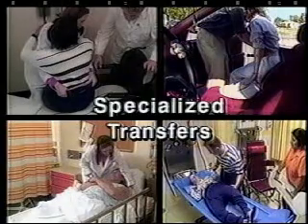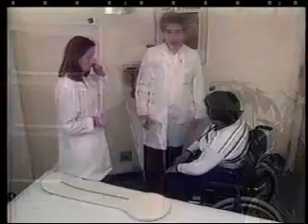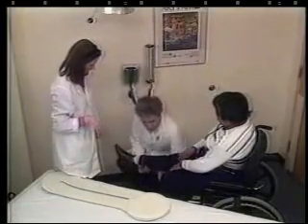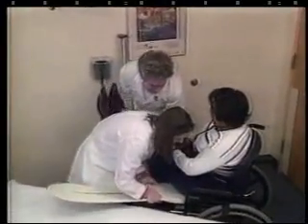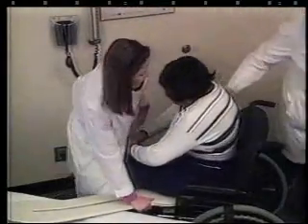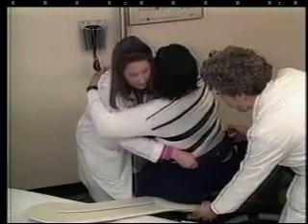With some wheelchairs, it is not possible to remove the arms. There are some little things you learn from doing that will help this transfer. One such technique is to approach the patient in a more head-on attitude than you would if the arms were removable. You can further assist the patient by lifting both legs and placing the system directly underneath him or her. Then, pull the patient forward in the chair until clear of the arms. Then use the Beasytrans rotating seat to turn the patient to the proper angle for the transfer.